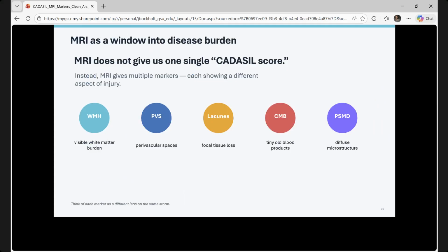It gives us the ability to compare and contrast the global and regional burden scores. And it serves as a way for clinical trials to use aspects of these features and measures when designing those trials, when conducting those trials, when assessing the results.